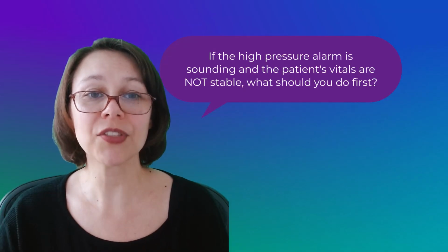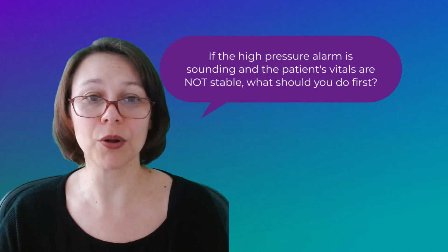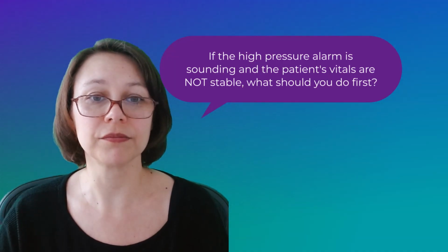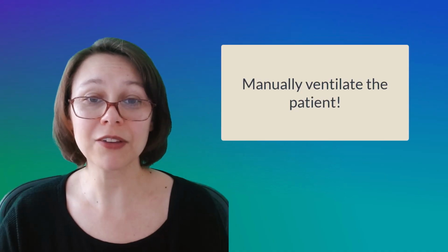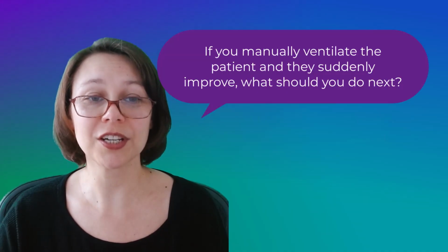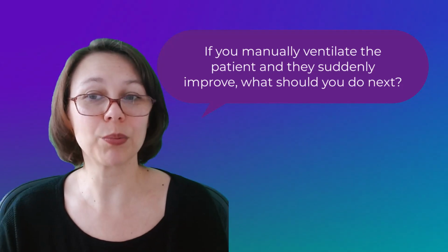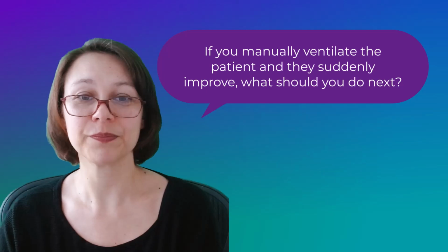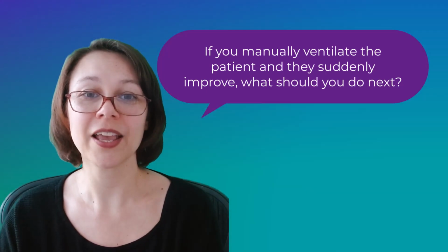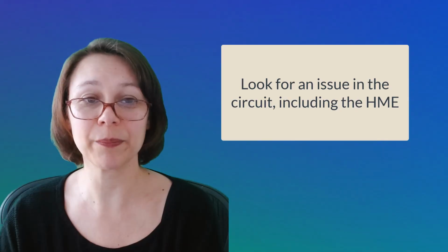Question 2, if the high pressure alarm is sounding and the patient's vitals are not stable, what should you do first? You should manually ventilate the patient. Question number 3, if you manually ventilate the patient and they suddenly improve, what should you do next? Look for an issue in the circuit, including the HME.